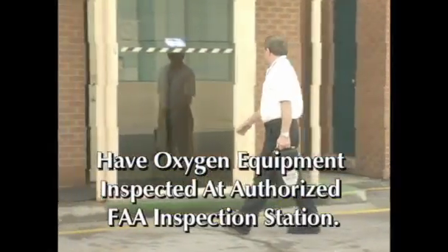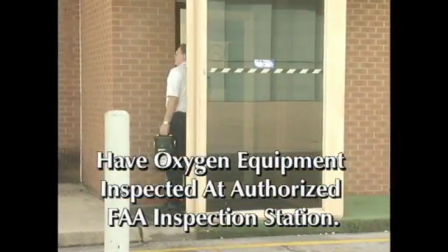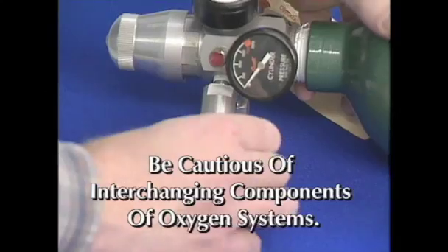Make sure your oxygen equipment is inspected regularly at an authorized FAA inspection station. Be cautious of interchanging components of oxygen systems. Ensure that all components, storage, regulators, and masks are compatible.